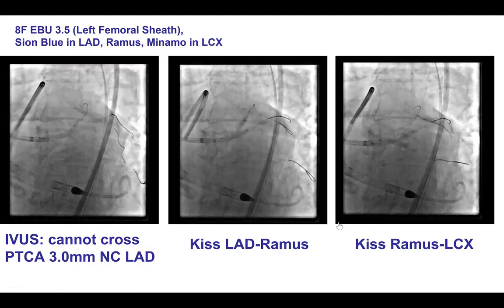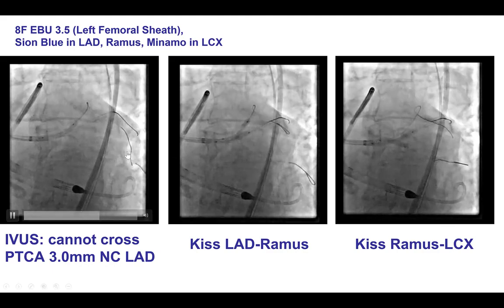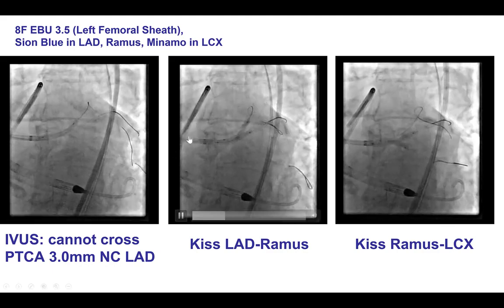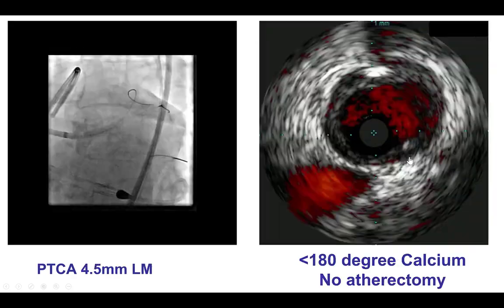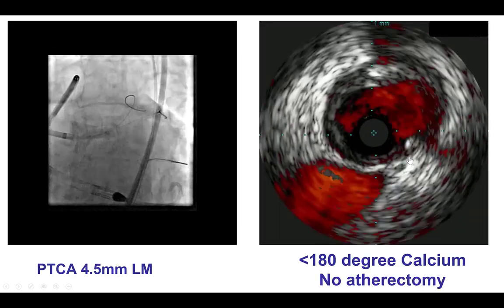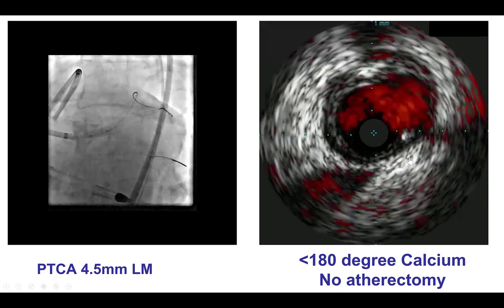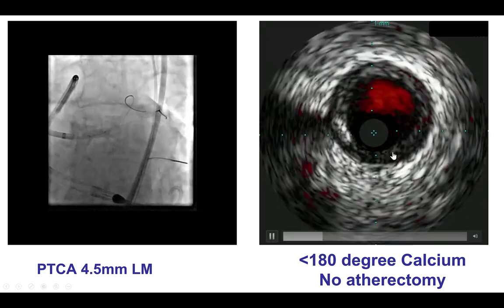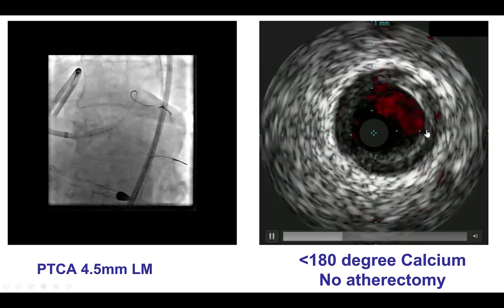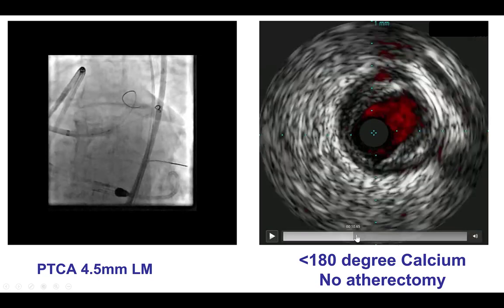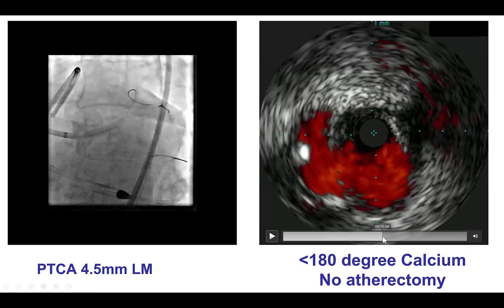We then wired all three vessels — we wanted to make sure we preserved all three vessels — and then did kissing balloon inflations in all three vessels. We were then able to deliver an intravascular ultrasound that demonstrated some diffuse disease. As we come closer to the ostium, there is the trifurcation.